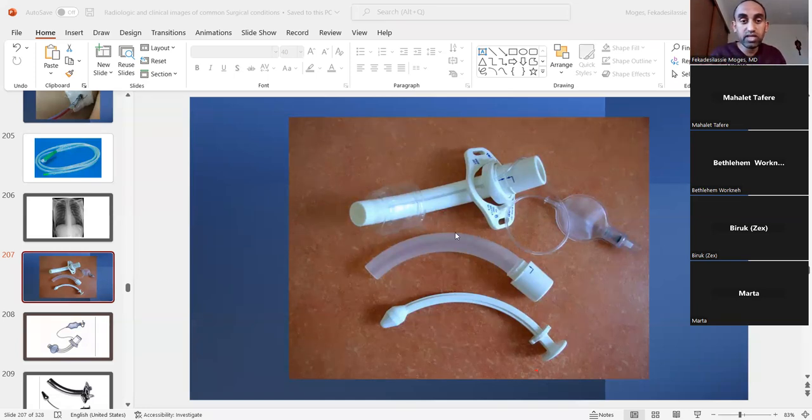What do you do after removing the inner tube? If you remove it, then clean it. Take it to the tap water and wash it. It has to be clean, but it shouldn't necessarily be sterile. And then you put it back again. Don't forget, you put it back again.